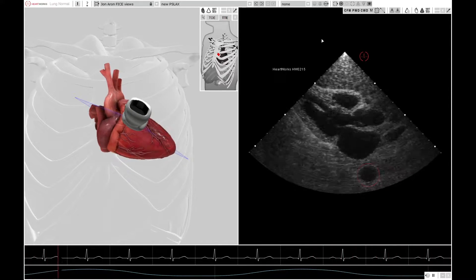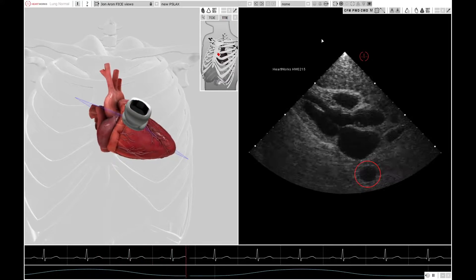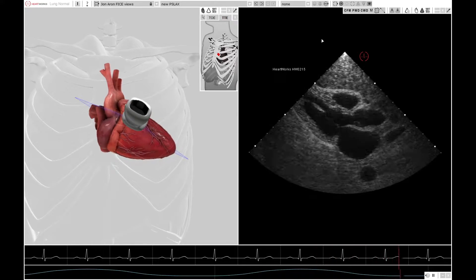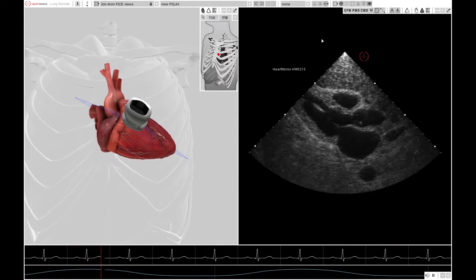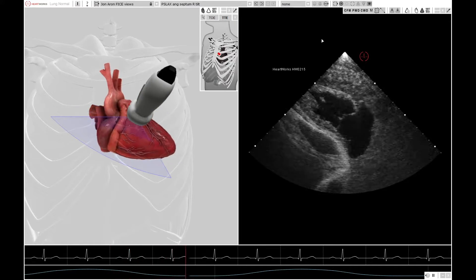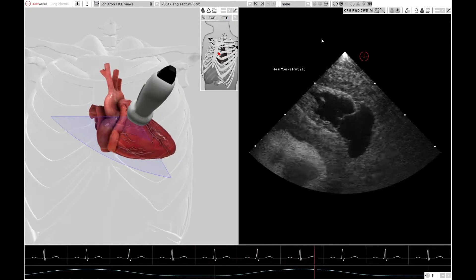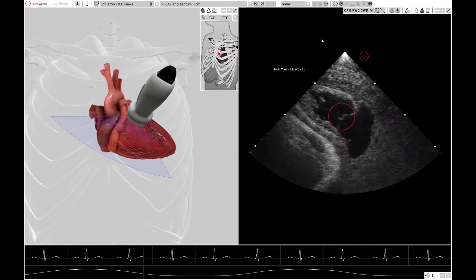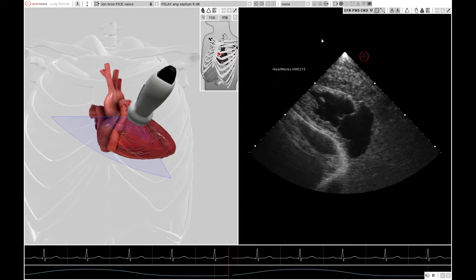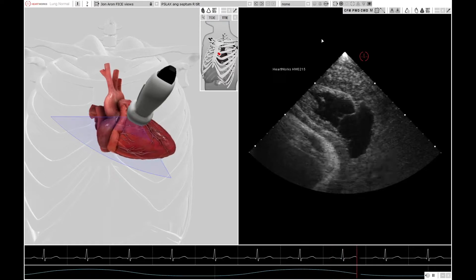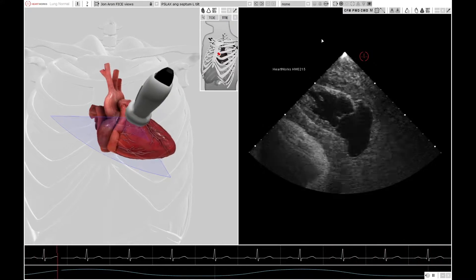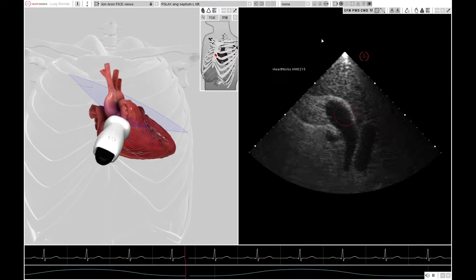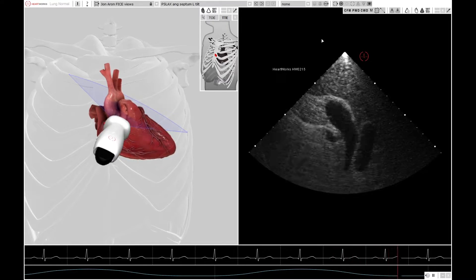Another important structure to recognise is the descending aorta, which you can see here, and which allows you to identify fluid around the heart as either pericardial or pleural. By tilting the probe towards the right of the heart, you can see the right ventricular inflow view and the tricuspid valve — this is not a FICE view, just to illustrate that if you see this, you need to tilt the probe back towards the left. Tilting too far to the left gives you the pulmonary artery and pulmonary valve, which is useful but not in the context of FICE.